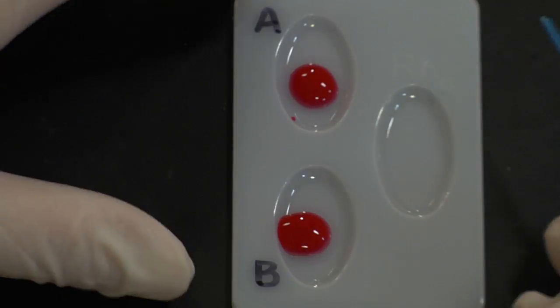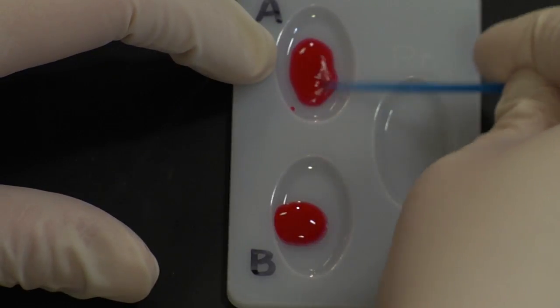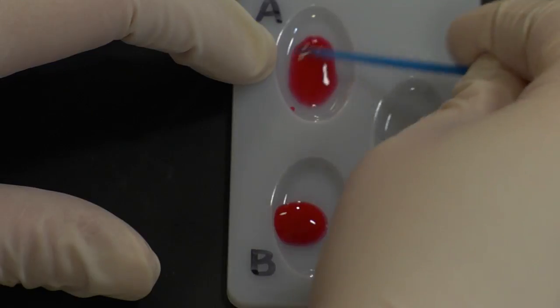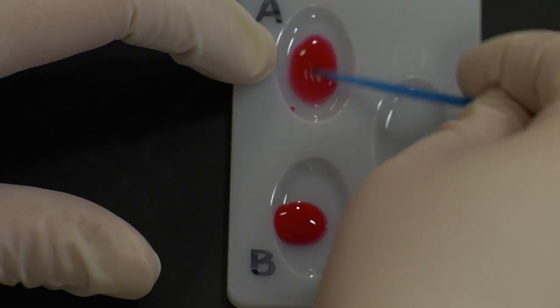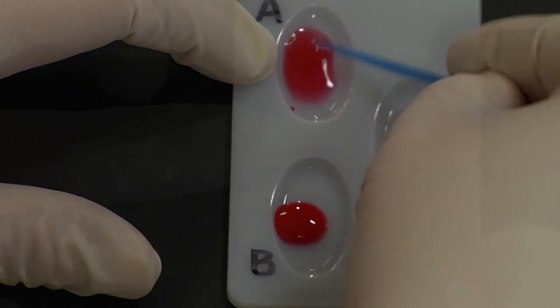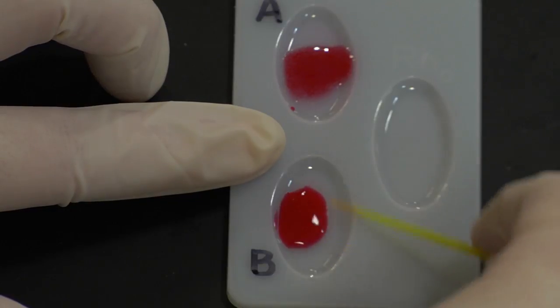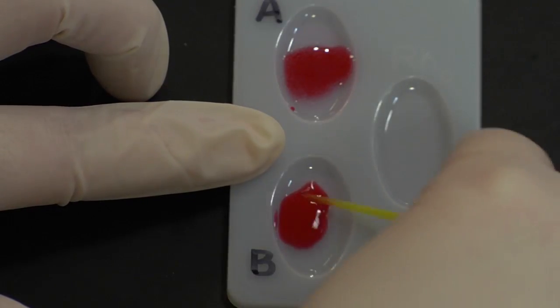Next I will stir the sample in well A with the blue toothpick, and I'll stir it for about 30 seconds. And I'll do the same in well B with the yellow toothpick, again for about 30 seconds, making sure not to slosh any out or make a mess.